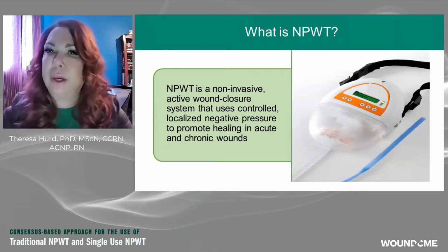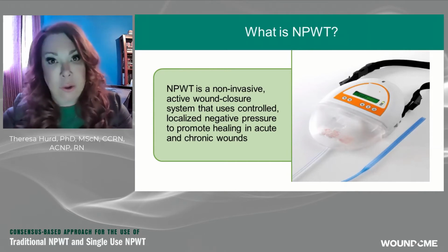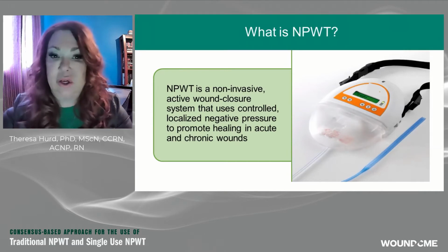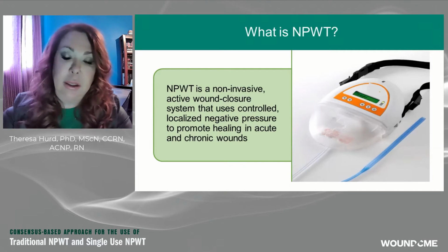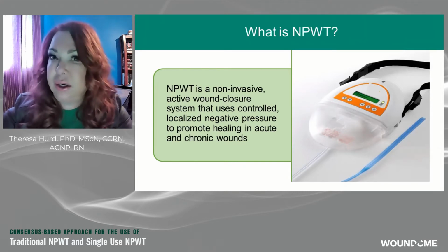So let's talk about negative pressure. Negative pressure has been around for quite a few years now. I was a very young nurse when it first started coming, and I'm no longer a very young nurse, so that means it's been at least 20 years or plus.